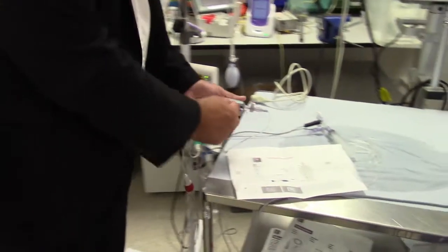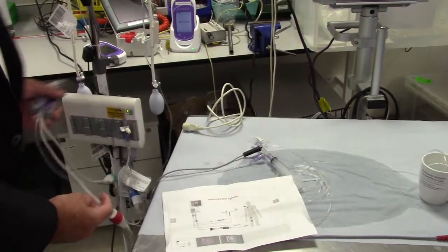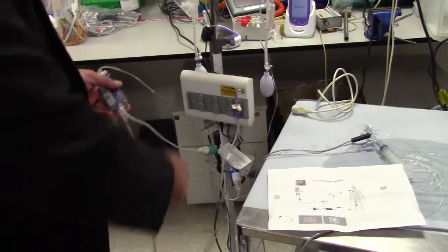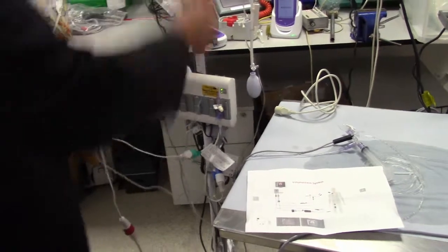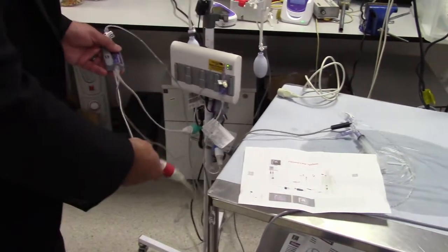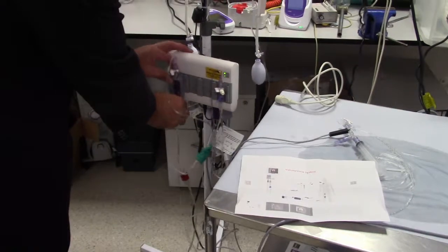See, there are actually two transducers here. I remember you mentioning that. So two transducers, which means there are two outputs. One goes back to the bedside monitor, and the other one goes back to this monitor. So the green to green is back to our monitor. The red would be the red that you take back to your standard bedside monitor. So that's the first part of that connection.